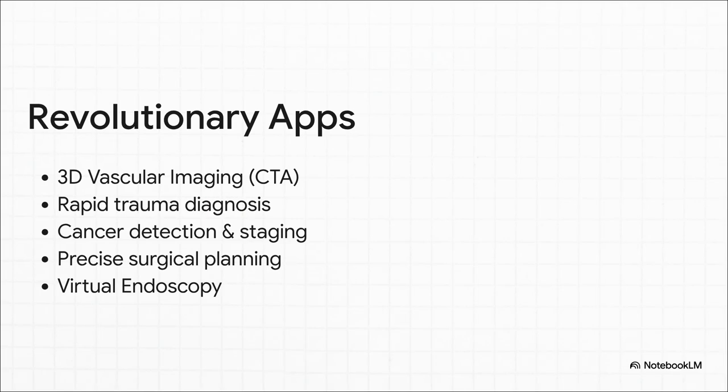This incredible speed allows doctors to freeze the motion of a beating heart, instantly assess injuries in a trauma patient, find and track tumors with millimeter precision, plan complex surgeries, and even perform virtual fly-throughs of organs like the colon, a technique known as virtual colonoscopy.